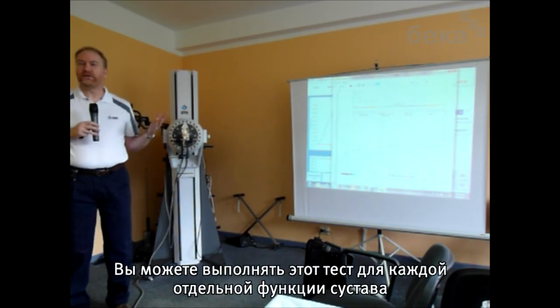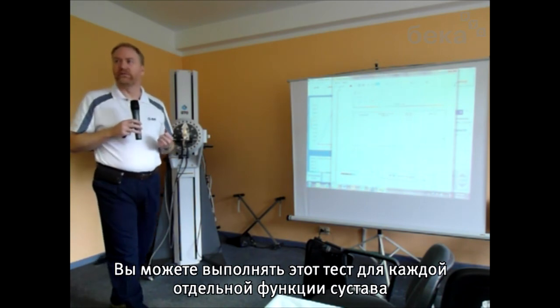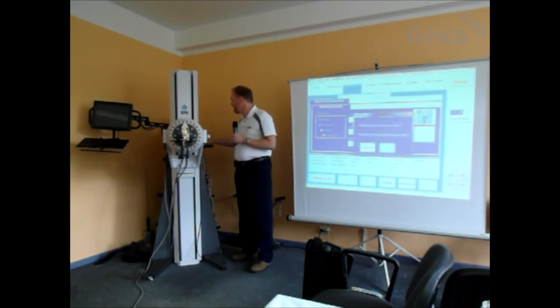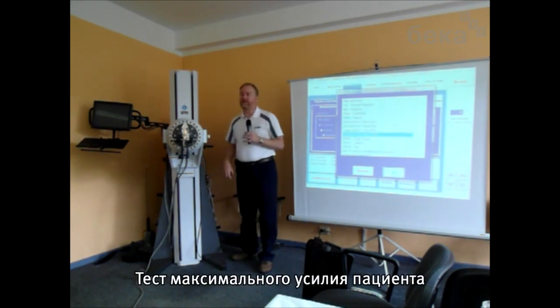And you can do this test with virtually any isolated joint function. The last one that we have built into the system is the alternating trials test. I'm sorry, the maximum voluntary effort test.